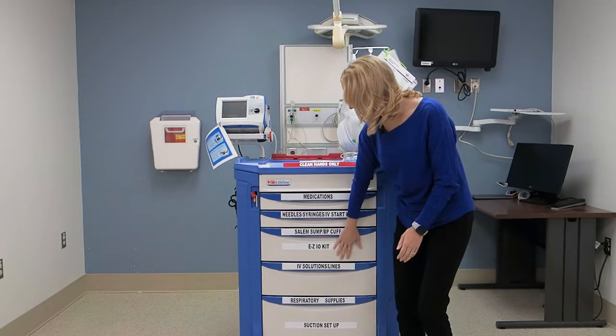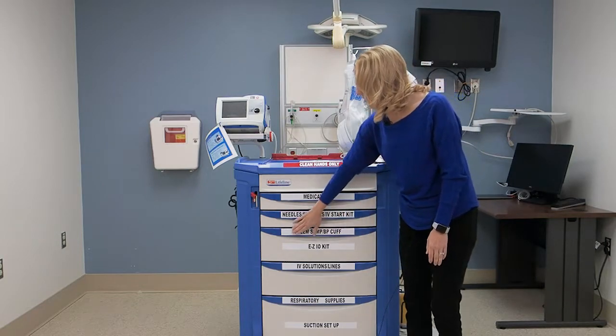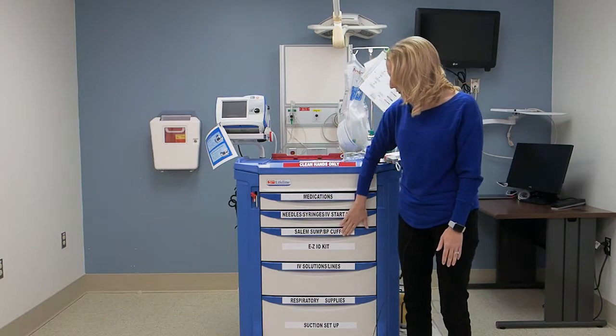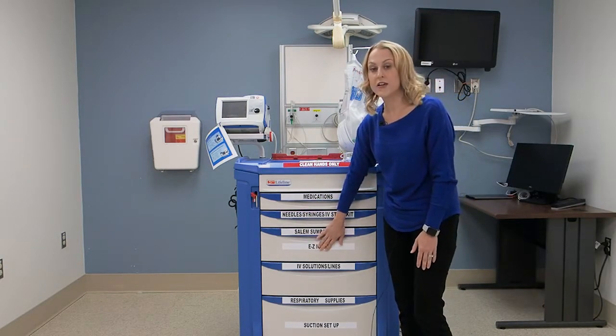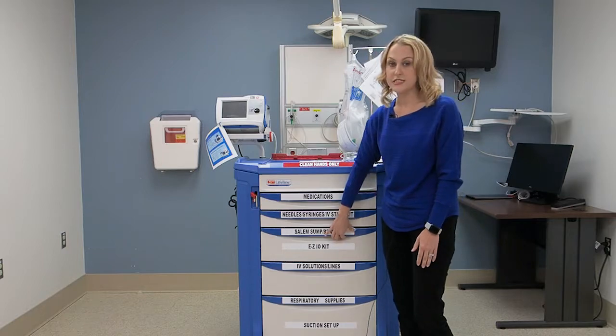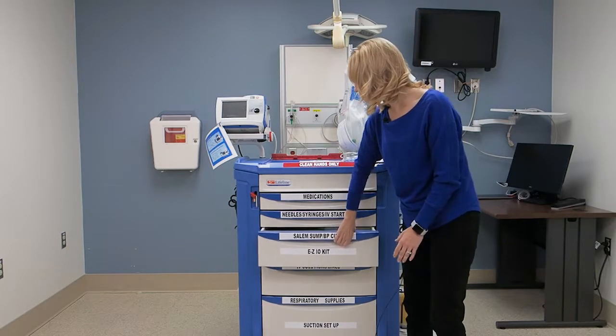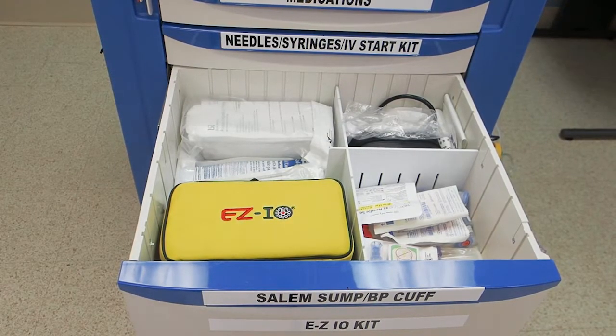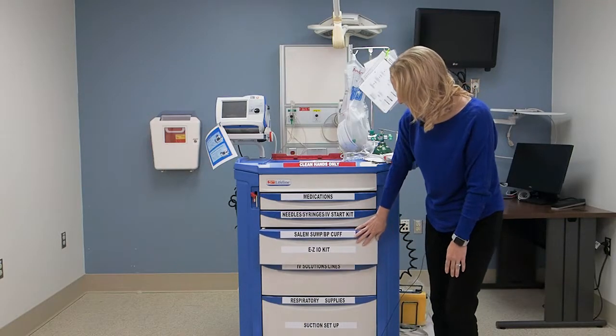This drawer is a little wider, has a little more in it. You're going to have your Salem sump in it, which is your NG tube, your blood pressure cuff, and then your Easy IO kit in the event that you need to insert an intraosseous needle. It's all there. You're going to find catheter tip syringes and an irrigation kit. You will find a blood pressure cuff and also a pressure bag if you need it.